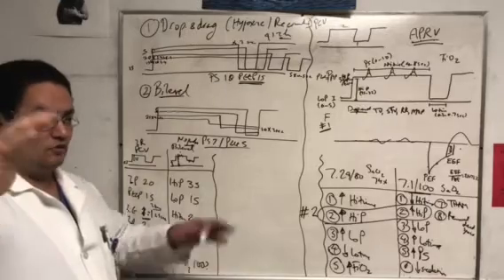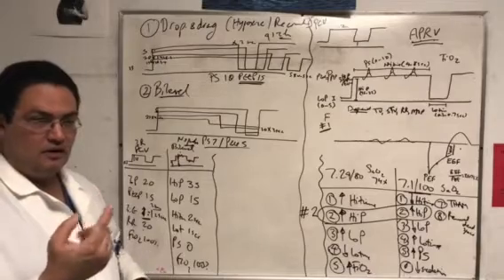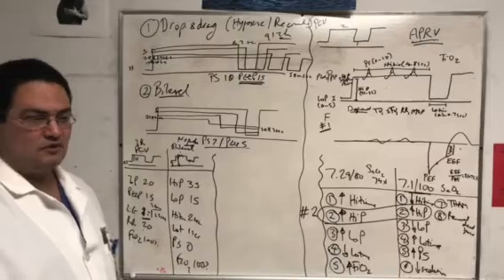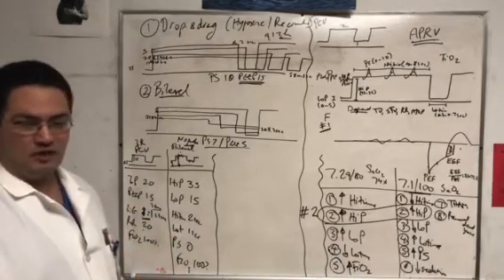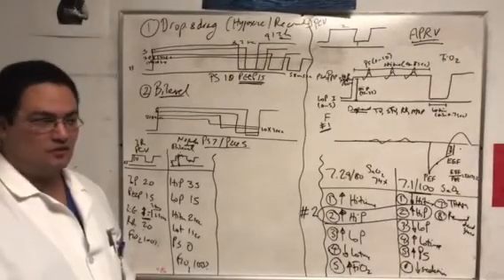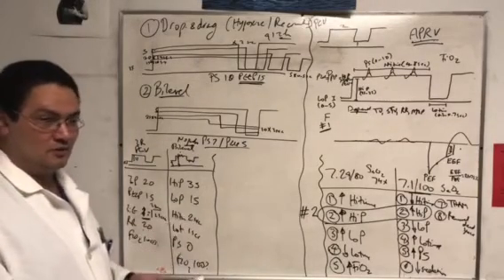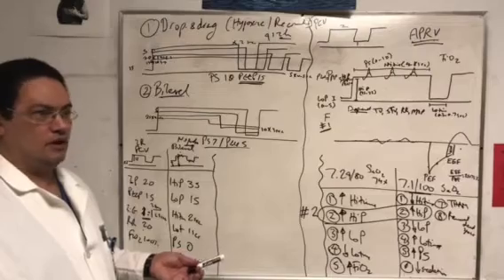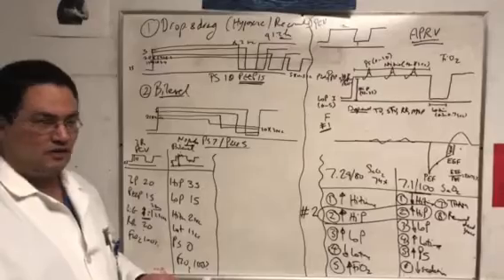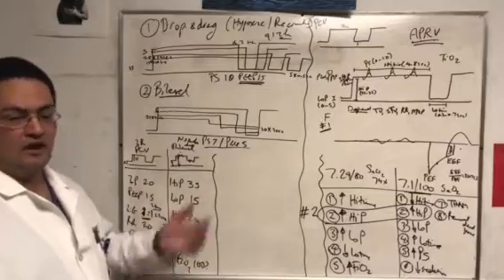When we had a huge respiratory department, and we were doing 1 SBT a day, that wasn't a problem, because the nurse, everybody knows what time, you turn off, the respiratory therapist comes, she calls the respiratory therapist, by the time they finish the breakfast, the patient is just waking up, and then they turn the thing to SBT. Nobody noticed that. But when we started to do 2 SBTs a day, and we lost some respiratory therapists, it became, okay, I turned it off, the respiratory therapist is in CAT scan. So nobody can turn the vent into SBT. So he remains on pressure control as he is waking up, and he breathes fast, and he has this problem.